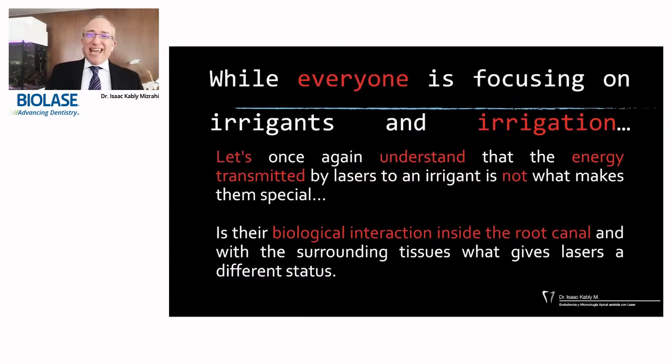Okay. So while everyone is focusing on irrigants and irrigation, let's once again understand that the energy transmitted by lasers to an irrigant is not what makes them special. You can deliver that energy to the liquid and it can bubble around and make a cavitation effect and everything, but that's not what makes lasers special.